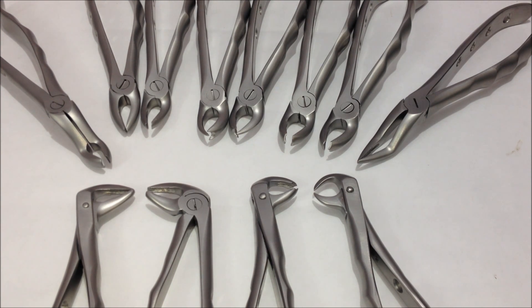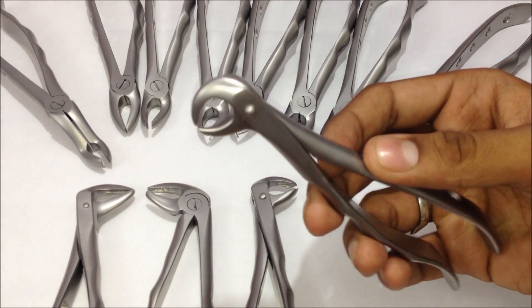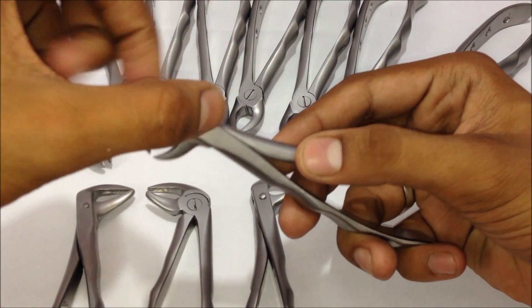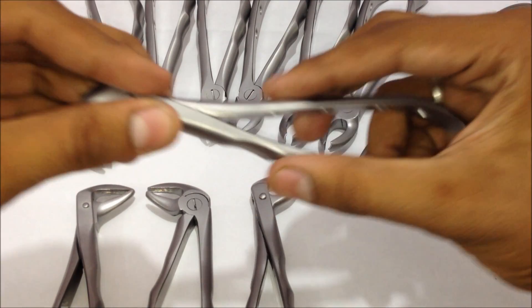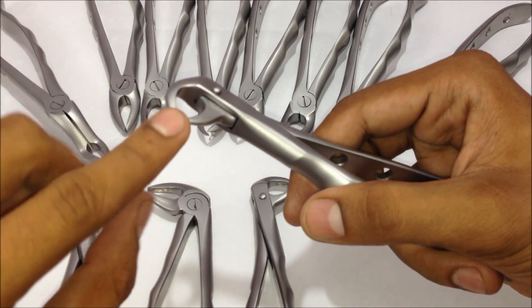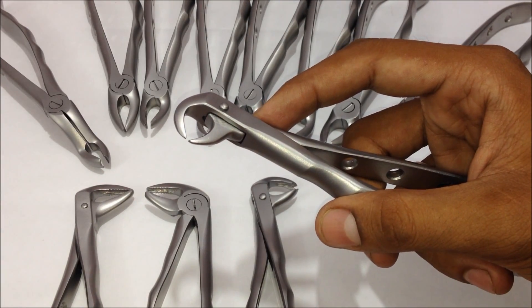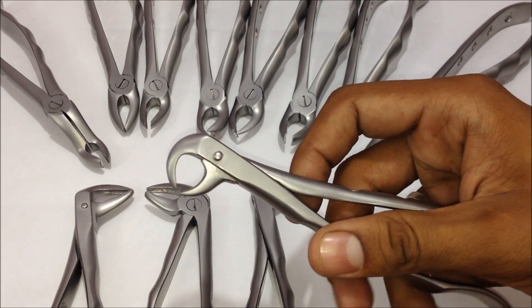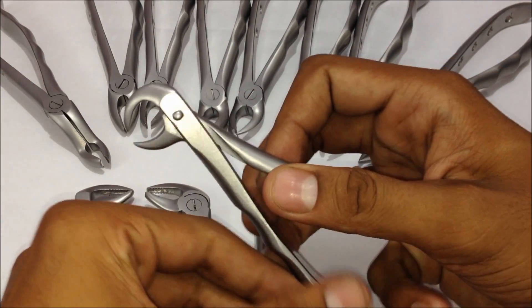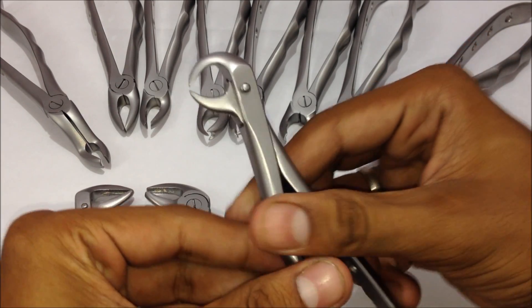The kit includes the incisors, canines, premolars, and molars. A forceps has three parts: the beak area, the hinges, and the handle. The beaks are the main differentiated parts — based on what the beak is, we can decide what extraction forceps it is and where it can be used. The hinge area helps in the suppression of the handles and the beaks.